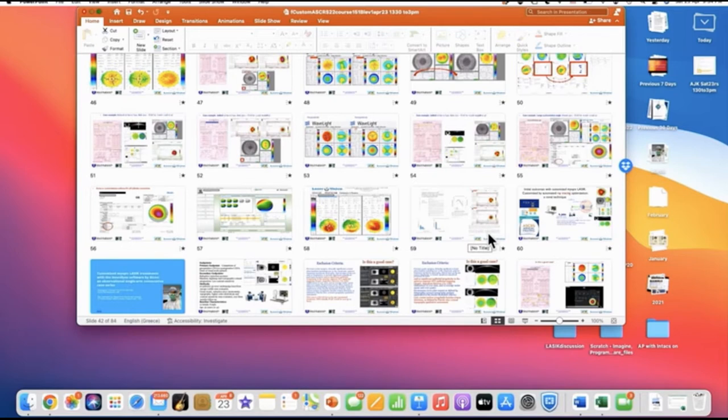So we go with our interferometry keratometries that are surface keratometries, and they only measure the central 2.8 to 3 millimeters of cornea, not total cornea. And we're assuming that the backside of the cornea is bringing in minus 6, and it's all spherical, or has very low astigmatism, which is usually the rule, but not always.